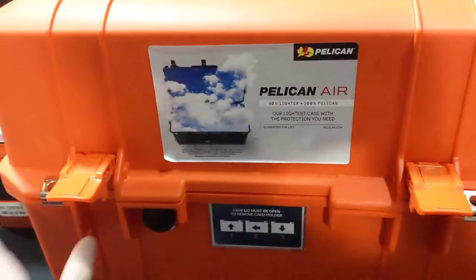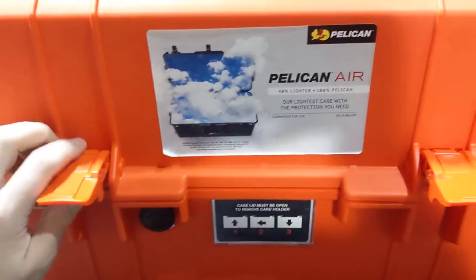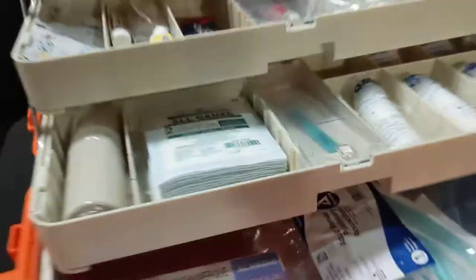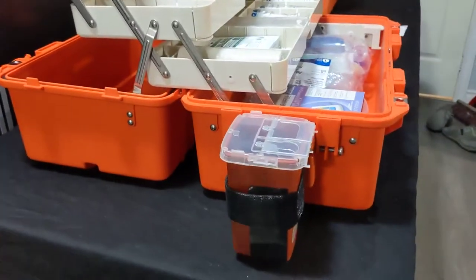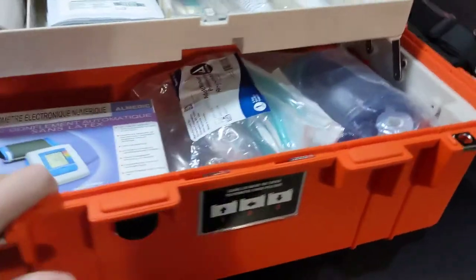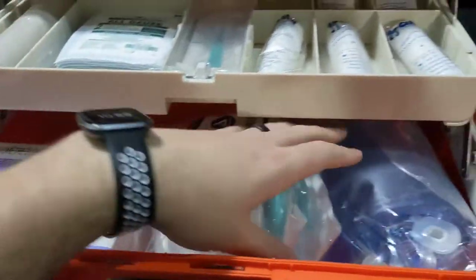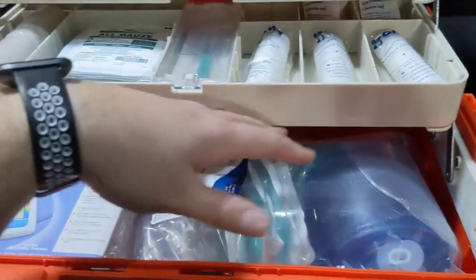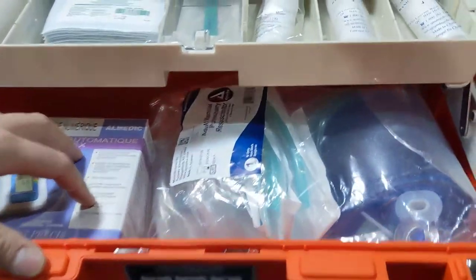The nice thing with all the Pelican EMS cases is they're really well organized, so you can set this up to do exactly what you want. It opens up fully and has its own base so it's not going to fall over — super secure, everything high quality hardware. Inside, you have a big bottom open tray for your larger items: assessment gear, BVM, larger resuscitation gear — anything large sits really well on the bottom.